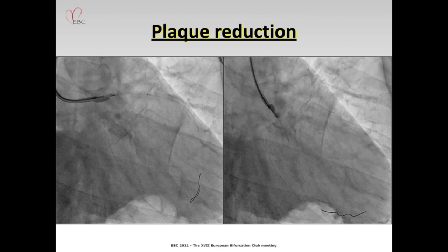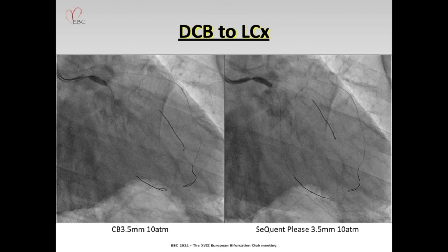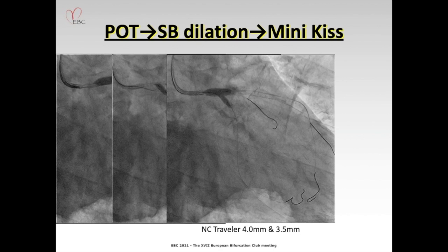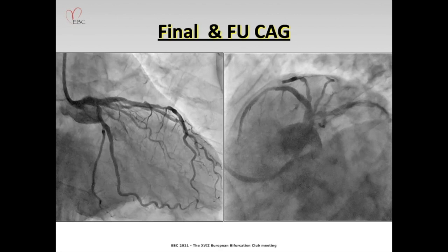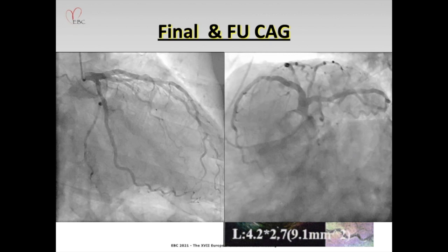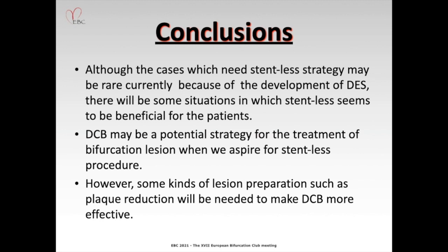The next case was a 60-year-old male with left main trifurcation disease. As I wanted to avoid complex stenting and carina or plaque shift, I performed atherectomy to both branches. After atherectomy, I dilated the proximal left circumflex with a cutting balloon and DCB, and then put two Synergy stents because the main branch lesion was very diffuse. After stenting, POT and minimal kissing was performed to fix this trifurcation. Final angiogram showed a good result. Although dissection was recognized at the proximal circumflex, I decided to observe it because the dissection was not malignant on IVUS image and percent plaque area was 46%. This dissection healed completely and there was no restenosis at follow-up.